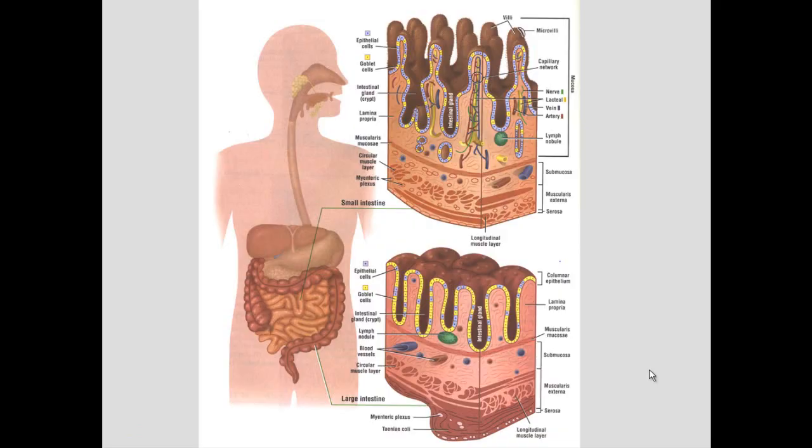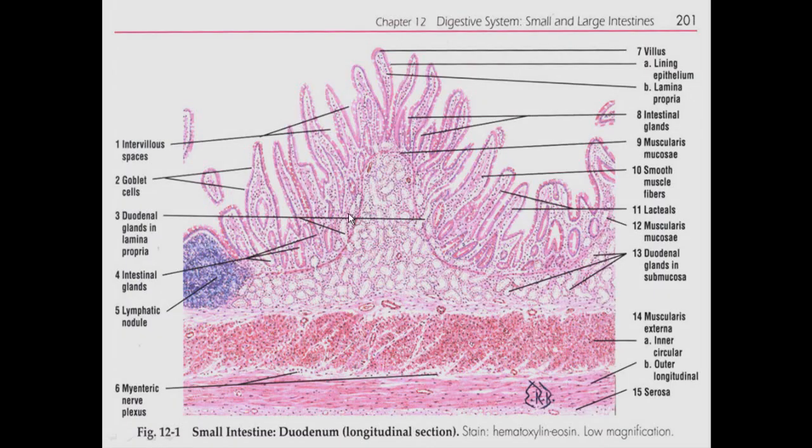Here we see the atlas view of the intestinal absorptive cells lining the intestinal villi, as we see at the top and through here. These are the intestinal absorptive cells lining this intestinal villus, which is located in the small intestines. Here we can see the small intestines with the villi projecting up through there, and intestinal absorptive cells can be seen through here, the pink that we see through there. The light components we see there are actually goblet cells.